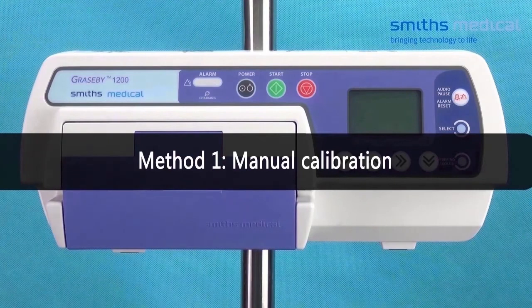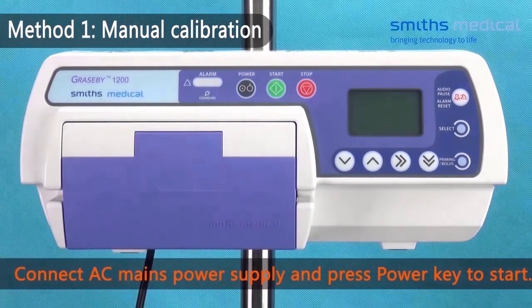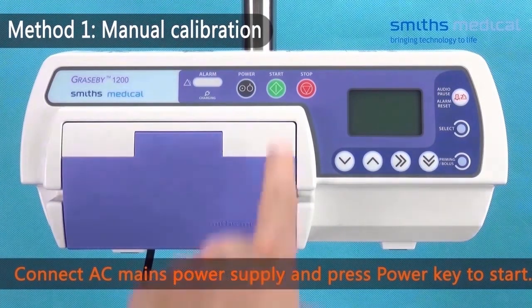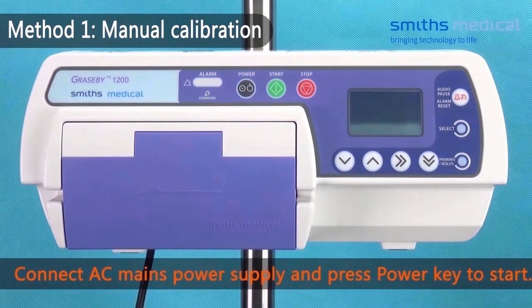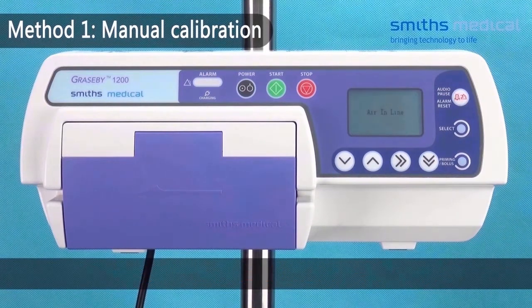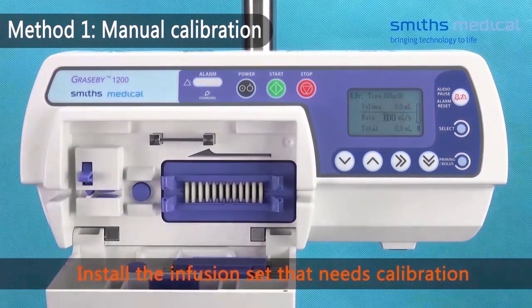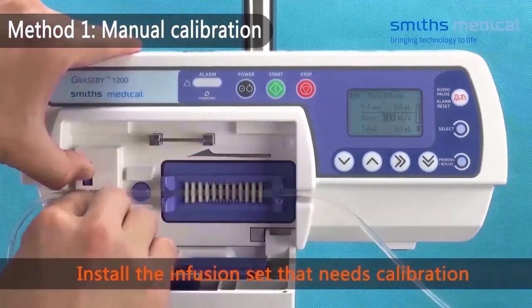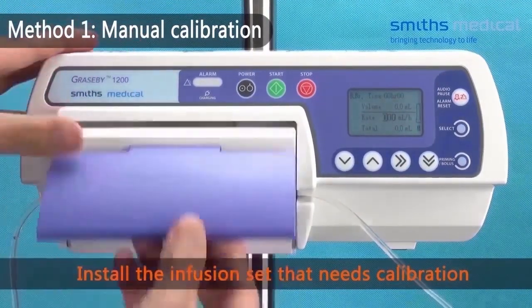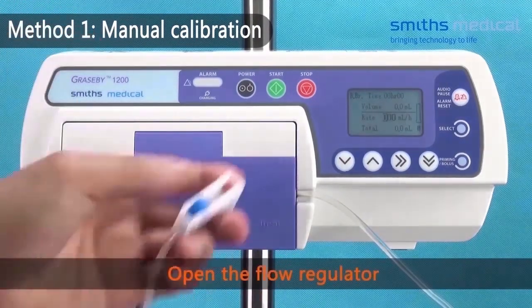Method 1: Manual Calibration. Connect AC mains power supply and press the power key to start. Install the infusion set that needs calibration. Open the flow regulator.